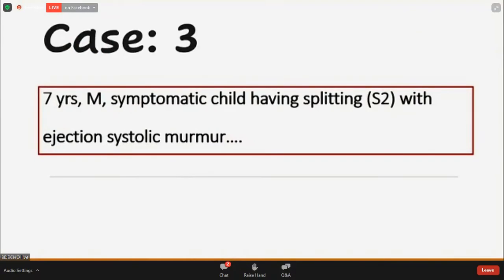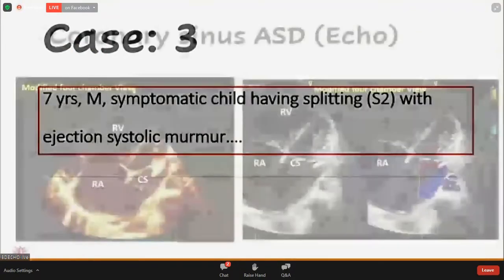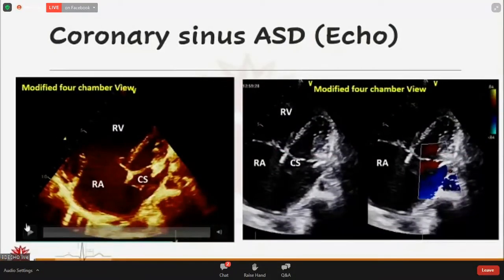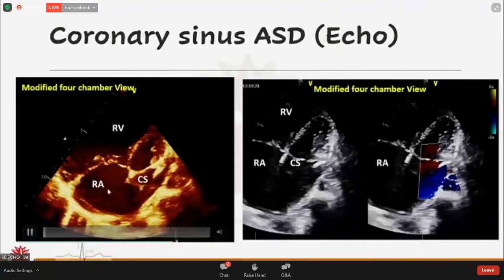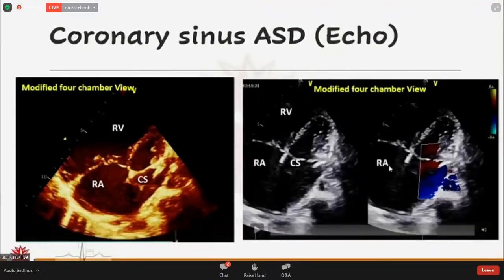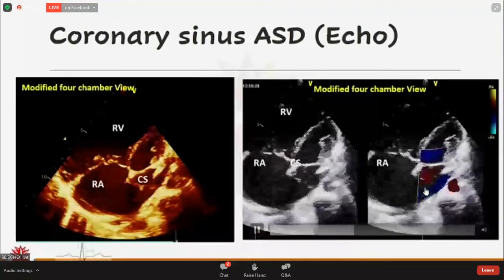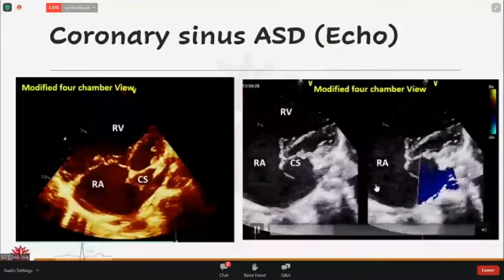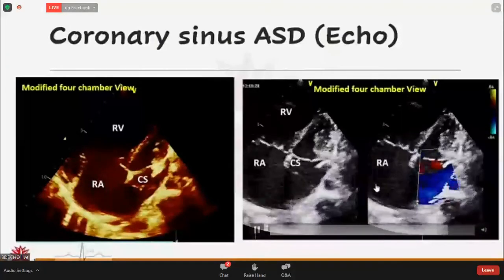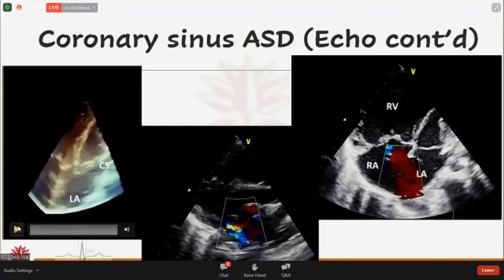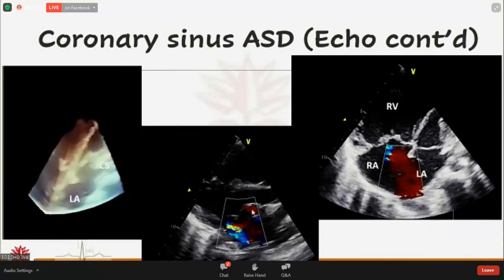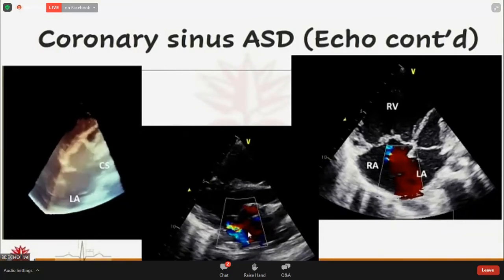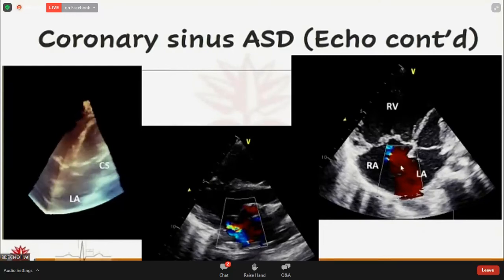My third and last case is a seven-year-old symptomatic patient with an ejection systolic murmur. Here also, the coronary sinus was dilated with unroofing of the proximal portion and unusually dilated right-sided chambers. We found a left-to-right shunt and anomalous left-sided upper pulmonary venous drainage. 3D echocardiography confirmed the proximal unroofing of the coronary sinus with the left atrium. This patient also had mitral valve prolapse with mild MR and an additional large secundum ASD.